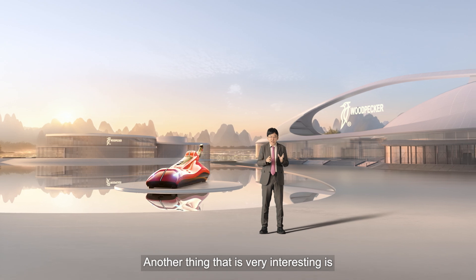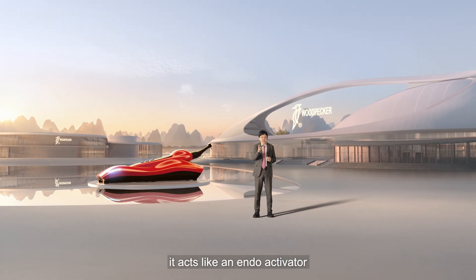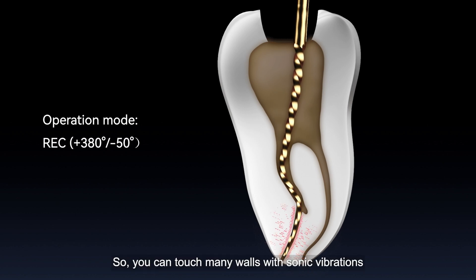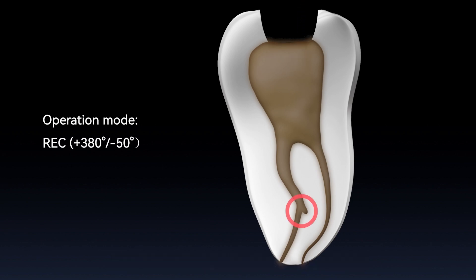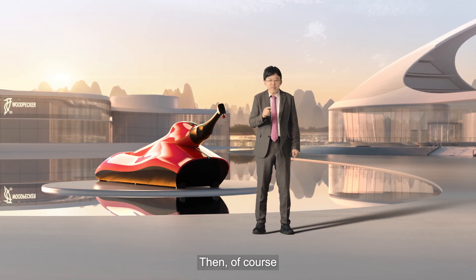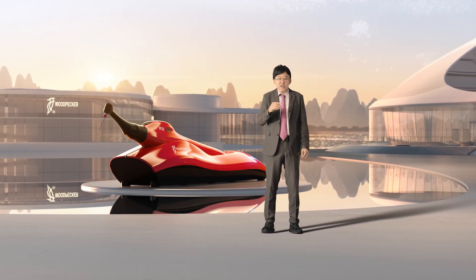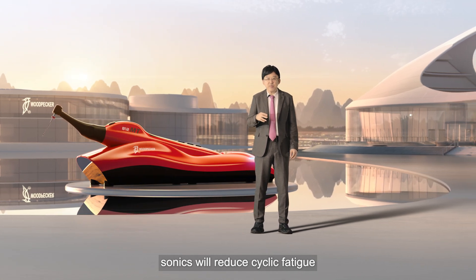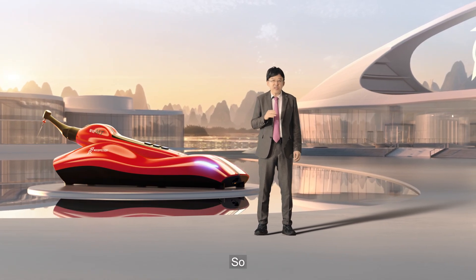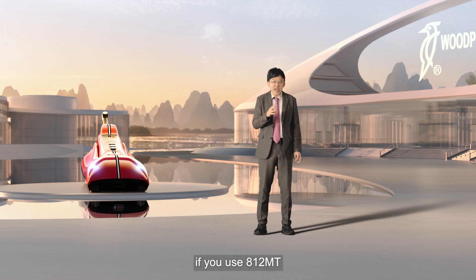Another very interesting thing: if you instrument the root canal with sonics, it acts like endo activators. With sonic vibration, you can touch many walls. That's why every time I instrument the root canal, I use sonics. Also, if you are instrumenting a canal with a crazy curvature, sonics will reduce cyclic fatigue — so I want to instrument those canals with sonics.